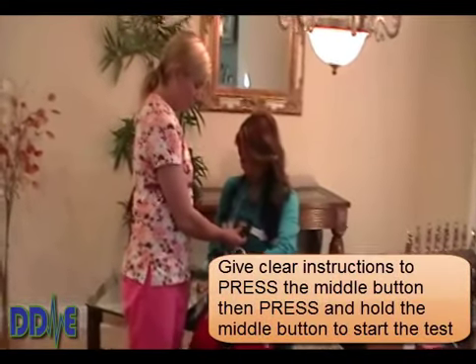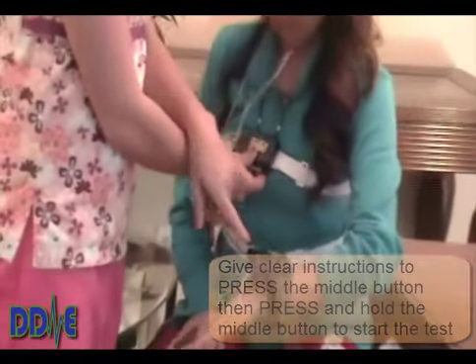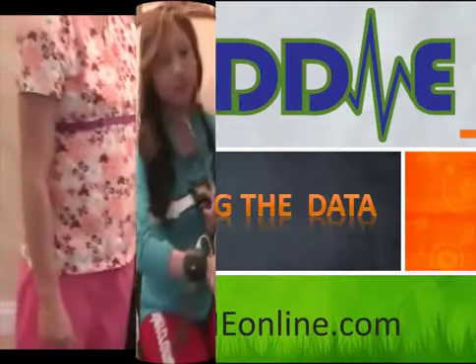Be sure to give clear instructions on how to start the study by pressing the middle button, then press in and hold until the status bar indicates recording has started. Also let them know that the blinking green light on the oximeter indicates the study is going.